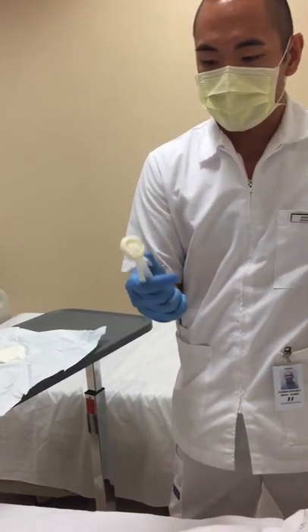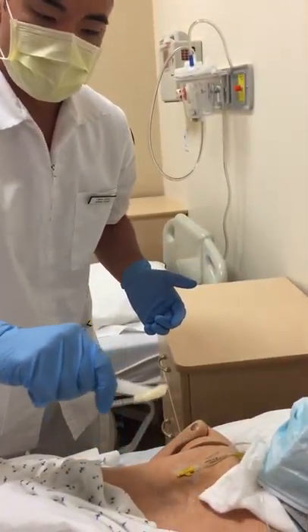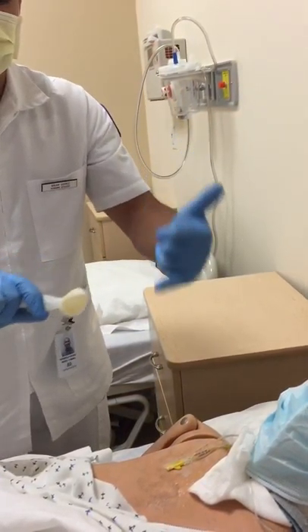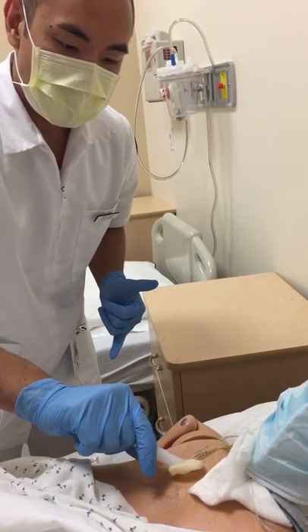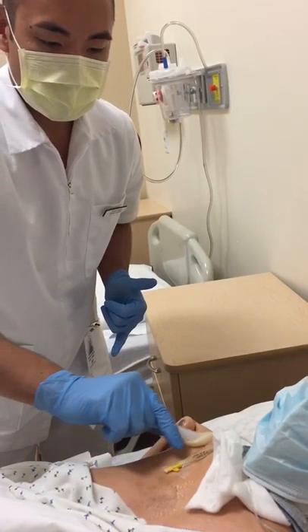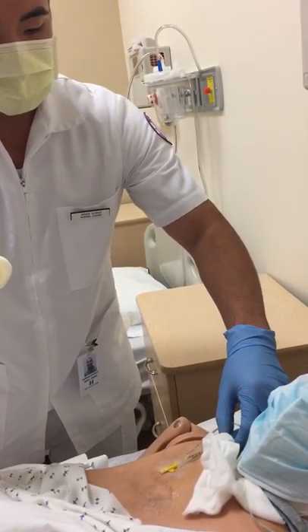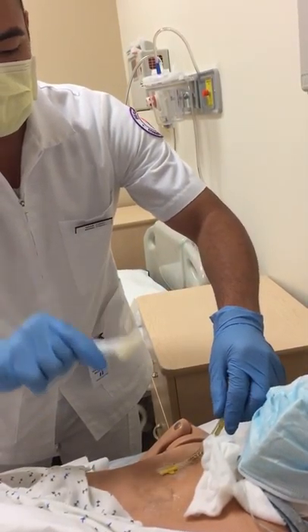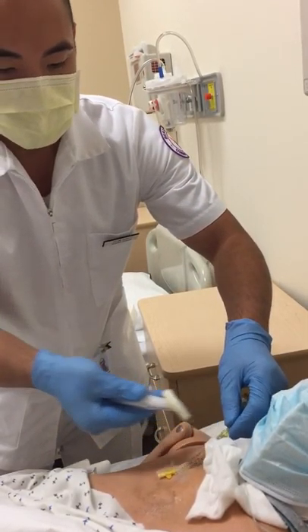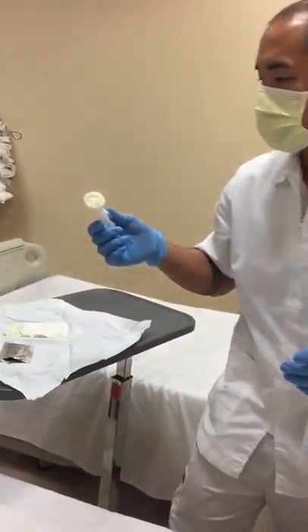This is dirty hand so I don't want to be touching that. Use the release mechanism when you squeeze. You're going to go from in to out — go in here first. I'm going to keep one side not touching anything because I'll use that to clean the lines later. Go around, then towards the outside, then one more around the most exterior border of the circle. Pick up the line and clean up here with the side that didn't touch the wound. Let that dry for a couple of seconds — this is dirty now.